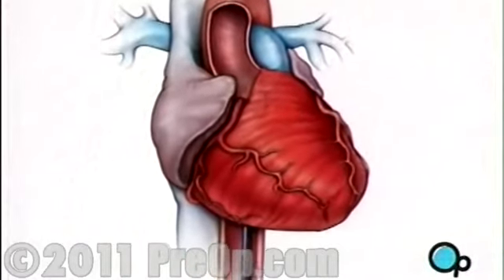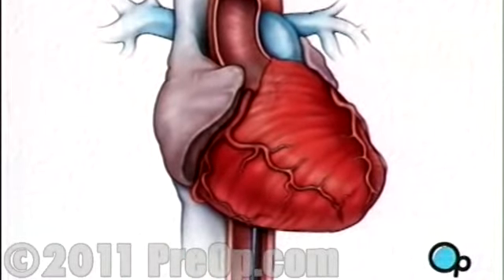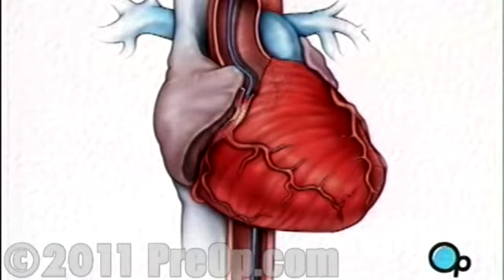A narrow tube, called a catheter, is threaded along the wire until it too has reached the coronary artery. Next, the doctor uses the catheter to inject a harmless dye into the artery itself. The dye shows up on a TV monitor and is used to pinpoint the exact location of the blocked area.